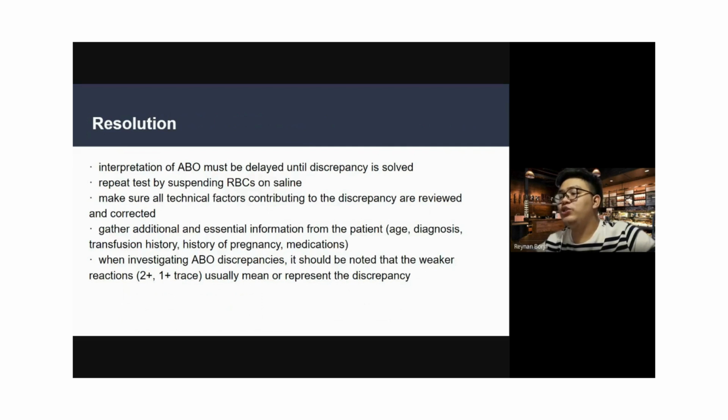So the best way to check this one is either i-wash mo yung red cell ni patient bago i-test ulit. Or either i-check mo, kung tube method man yung ginamit mo, i-check mo sa slide, ilagay mo sa slide, i-check mo sa microscope if it has Rouleau formation. Kung hindi siya agglutination, i-report mo na Rouleau formation. Or, better i-wash mo yung RBC and repeat it.